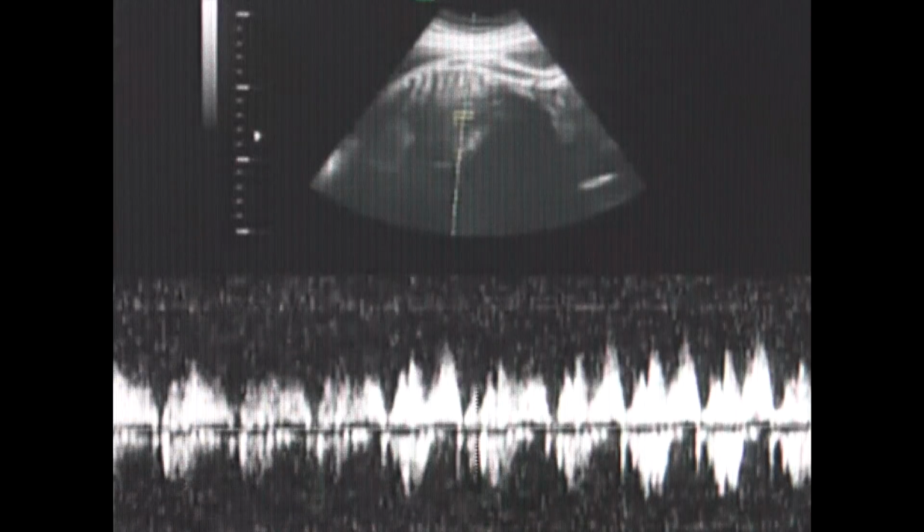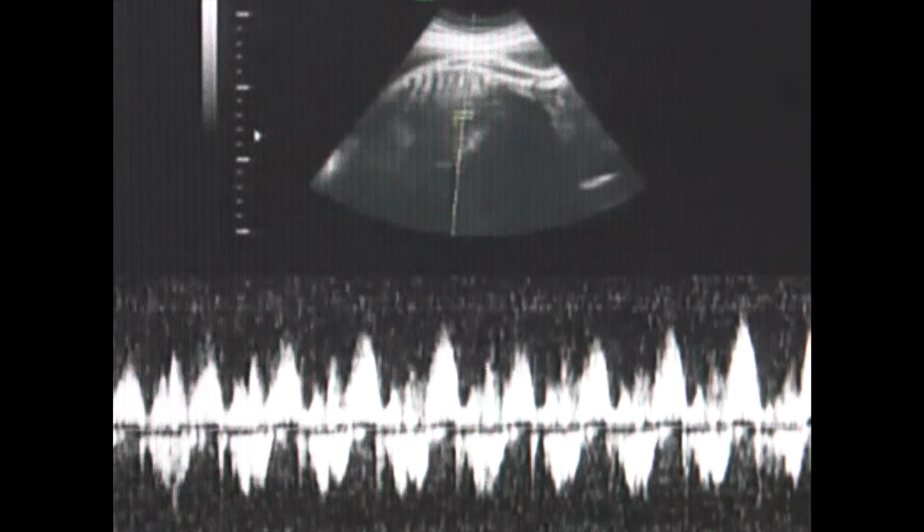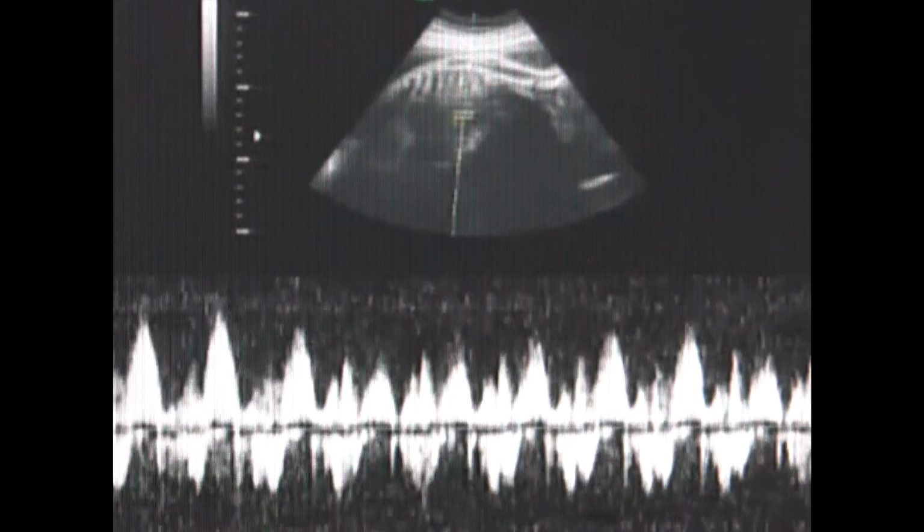Does it say how many beats? Actually, if you just find that out, then I'll do it. The backbone. Heart rate's 140 beats per minute, which is within the normal range, so that's good. All right, now turn back on your back. Just on your back. Oh, it's normal. So she did turn.